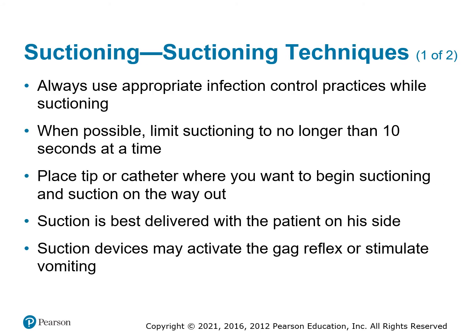You need to make sure you have the correct PPE on. If you're suctioning, that means that there's fluid, that there's liquid, that there's something. So you need to protect your eyes because you have mucous membranes in your eyes. You should have a mask on so you don't get stuff in your mouth or in the mucous membranes in your mouth or nose. And you need to have gloves on.